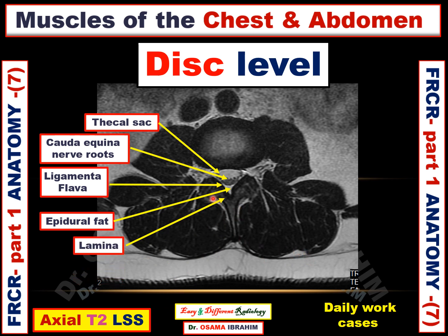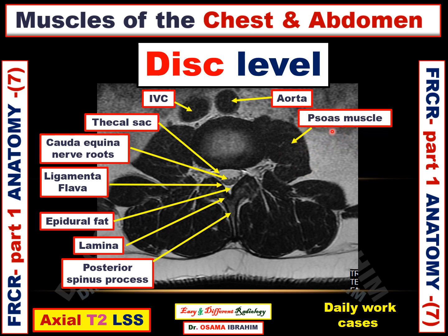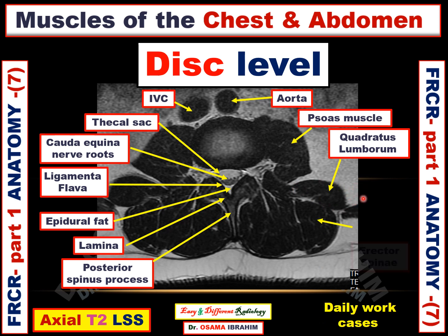This is the lamina — right lamina and left lamina — and this is the spinous process posteriorly. These two rounded structures anterior to the vertebra are the inferior vena cava and the aorta. This muscle appearing in the paraspinal region anteriorly is the psoas muscle. The muscle between the psoas muscle and the erector spinae muscle is called the quadratus lumborum muscle. And this one is the erector spinae muscle.